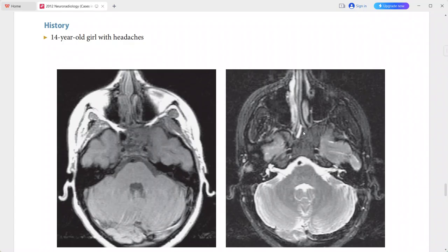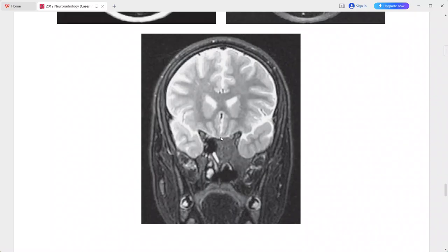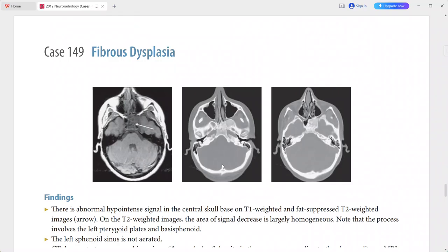The process involves the left pterygoid plates and basisphenoid. The left sphenoid sinus is not aerated. On CT scan, there is a geographic area of ground glass density corresponding to the abnormality on MRI. This is a case of fibrous dysplasia.